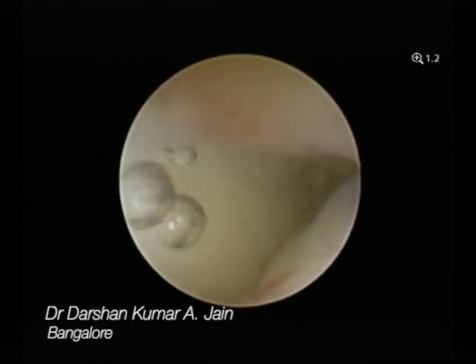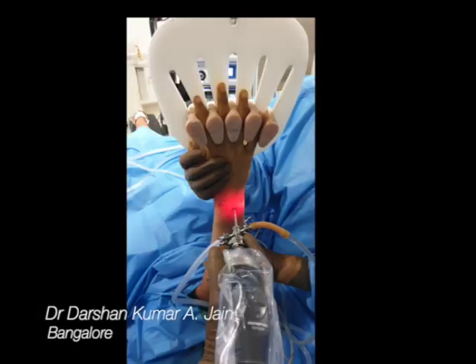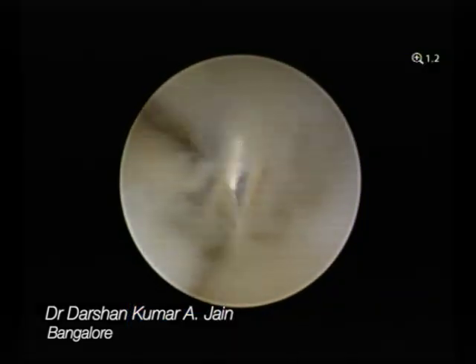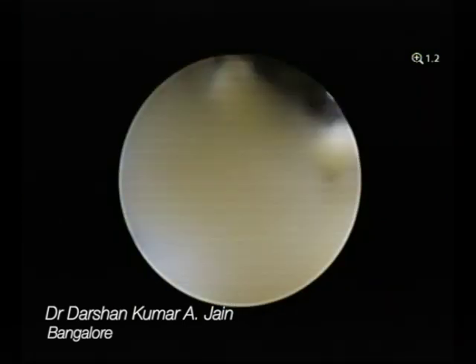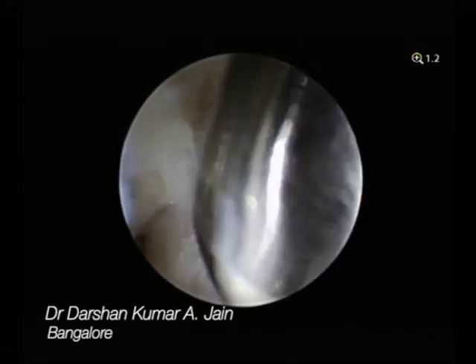You can see the mucky fluid there. Once you irrigate that, you make another portal. First you inspect the radiocarpal joints, then you do the DRUJ arthroscopy. That is the portal you are viewing through. Next you go to the working portal — that is the needle there. Then you introduce your shaver.